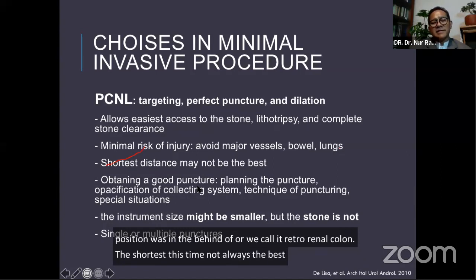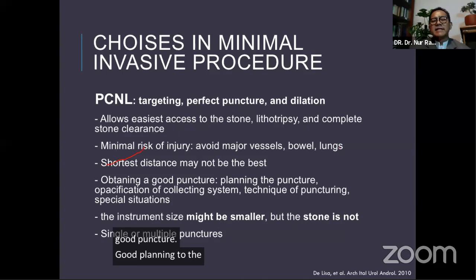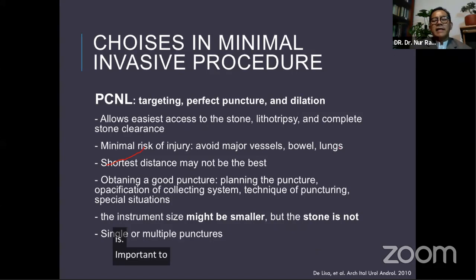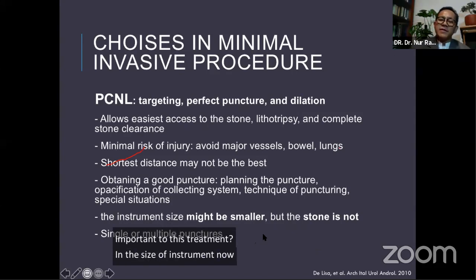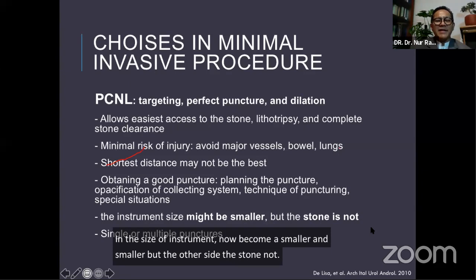Obtaining a good puncture needs good planning, opacifying the calyceal system with contrast, and the technique of puncture is important to this treatment. And the size of instruments now becomes smaller and smaller, but on the other side, the stone is still in a big size in our country.